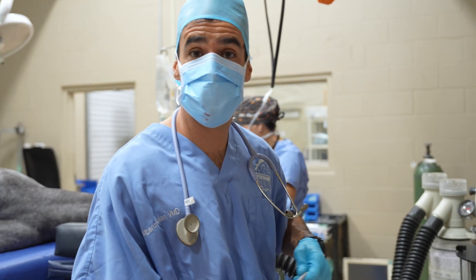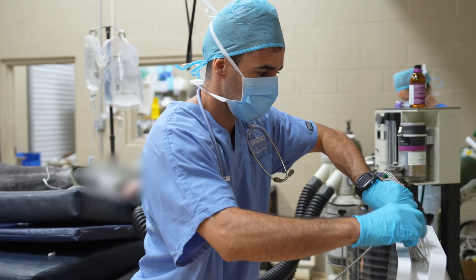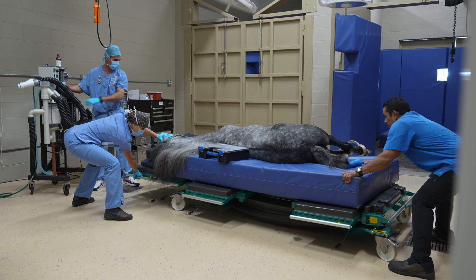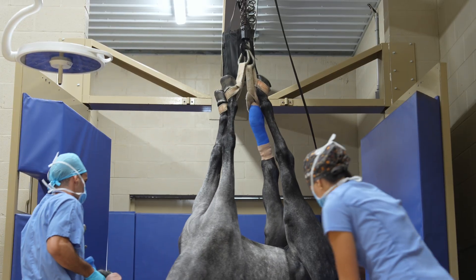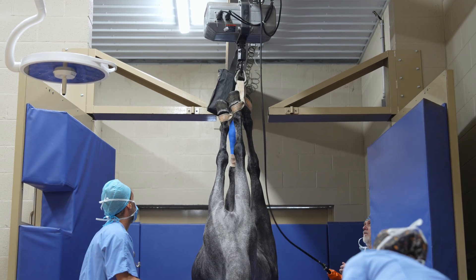The surgery is done. Now we're going to disconnect him from fluids and all the monitoring, and we're going to roll him over to the recovery room.